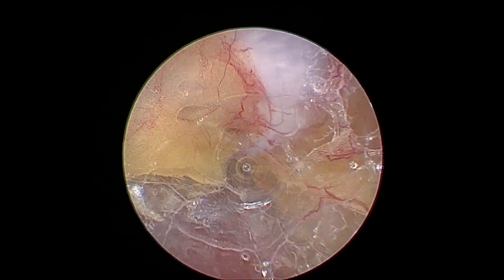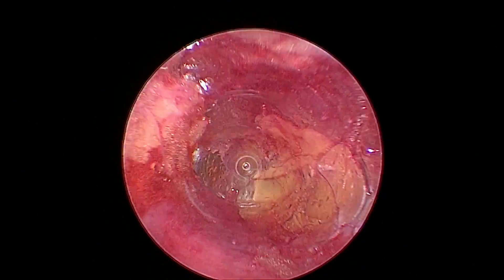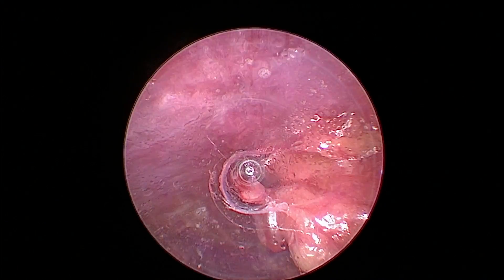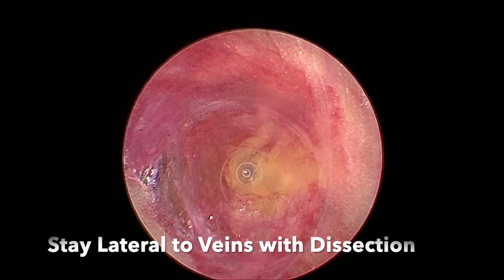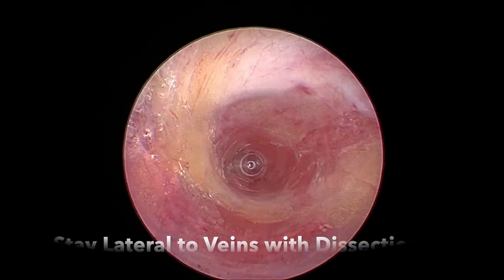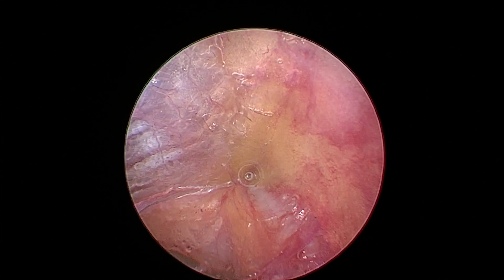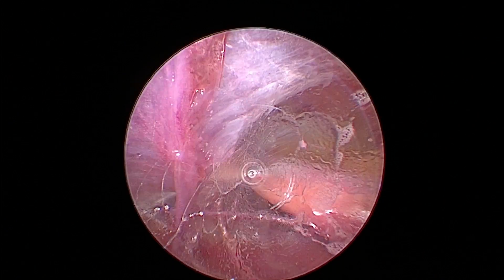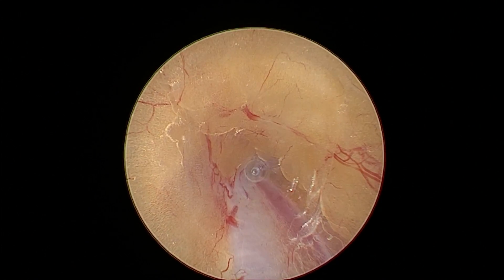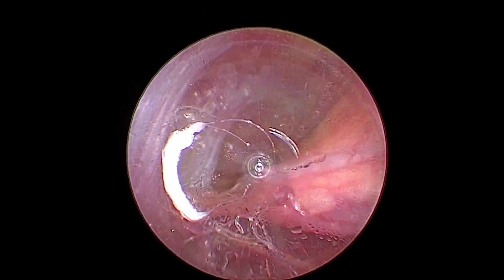Fortunately for this patient, I was able to go very far up, very close to the antecubital fossa. There's that pedicle intact — that's what you want to see. I'm just checking now to make sure I'm completely clear on the right side. I've gone all the way up posteriorly, and now I'm going to finish taking the vessel down as a pedicle anteriorly, working lateral to the veins and not on the radial artery. There's much less resistance up here in the top of the forearm, and it becomes more like a saphenous vein case — you have a nice tunnel and can work more freely.